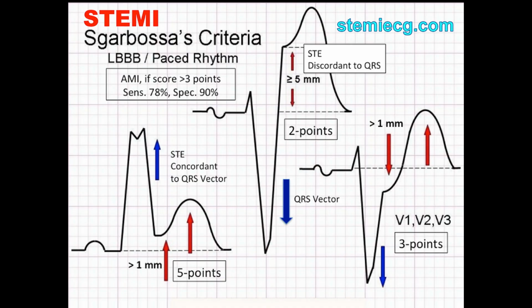2 millimeters there. Okay, what's the second criterion? It has to be in contiguous leads. That means leads that are looking at the same neighborhood, the same wall of the heart. For example, leads II, III, and aVF all look at the inferior wall. If you see ST elevation on all three, that's significant. V1 to V4 look at the anterior wall, usually supplied by the LAD artery. So localized elevation in neighboring leads. Got it. And the third thing, the real clincher.